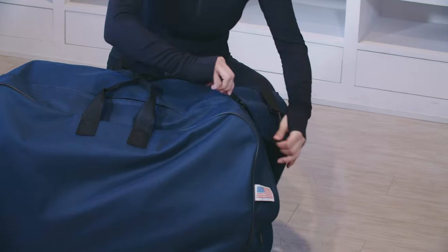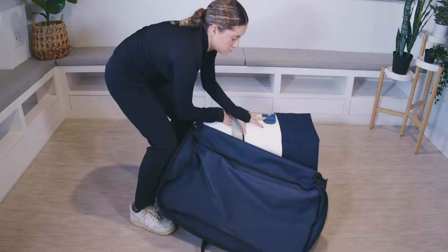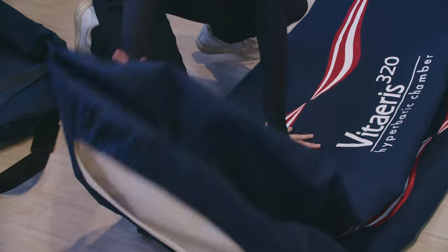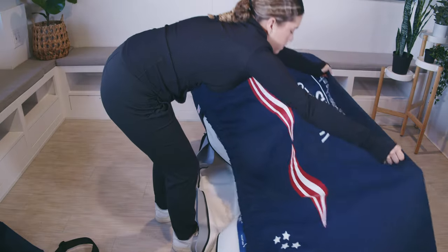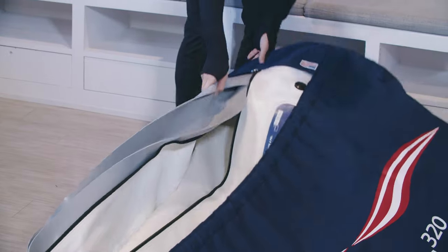Grab the chamber carry bag, unzip it, and take out the folded chamber. Unroll the chamber, opening and unfolding it completely. Turn it right side up with the zipper and opening facing up. Continue to unfold and flatten as much as possible.